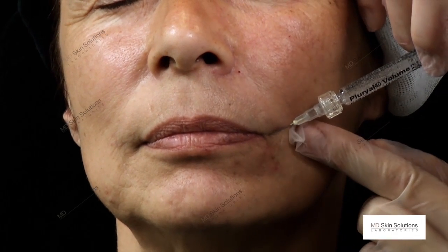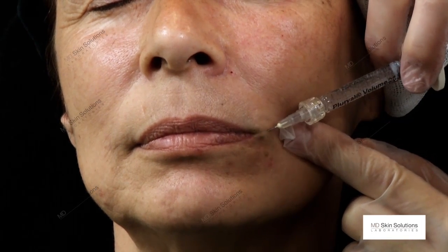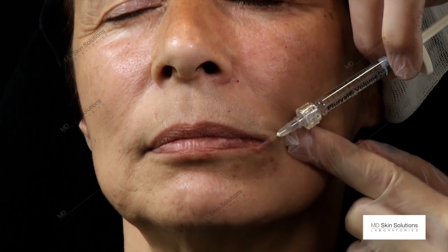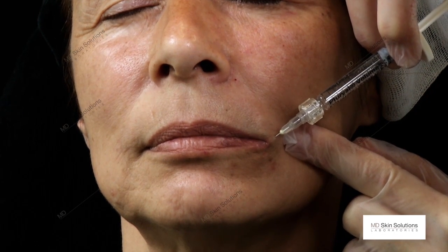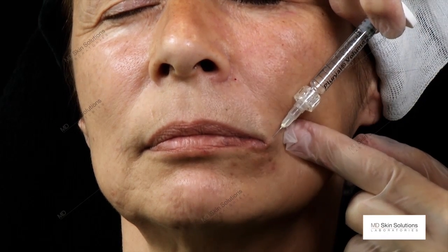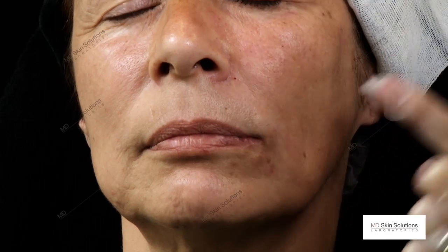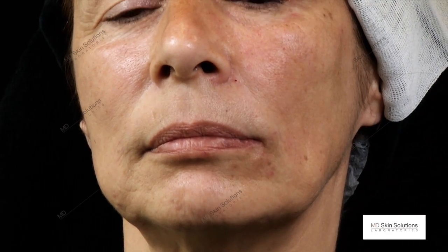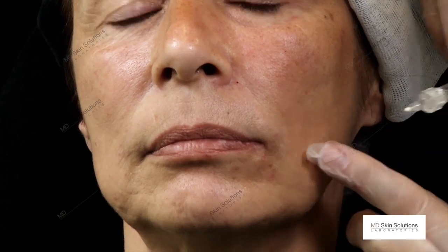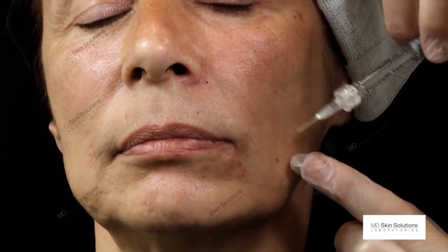The second injection will redefine the corner of the mouth. I needle up the red-white line of the lip, and I inject gently with a gentle pressure on the plunger, just this little line in order to lift up the corner of the mouth. It's like building a house, doing a foundation to re-give volume where it is lost, and then to redefine by giving a topping, again with the Pluryal Volume, which is a very suitable filler for this indication.